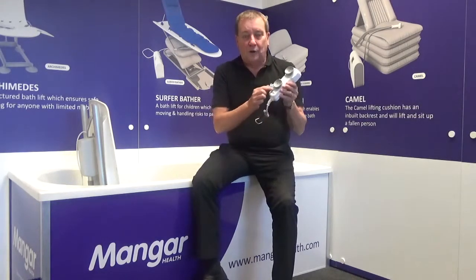Before we can use the bath lift, we want to look at the handset that we receive with it. First piece of advice here is to put this on charge overnight before we actually use it. The batteries are contained within the sealed unit. And one other little thing to notice here, amongst all the numbers on the back, there is something called an IP rating. The IP rating on this is 67. It basically means it's splash proof. So if this unit did drop into the bath, it could be just lifted out, dried off, and would be okay to use.